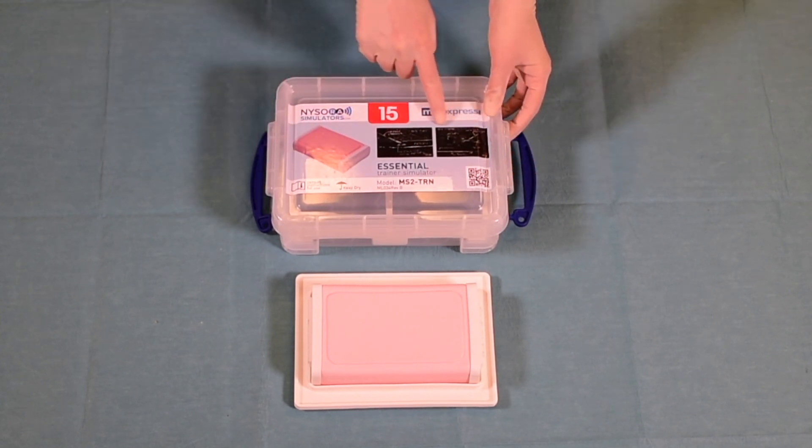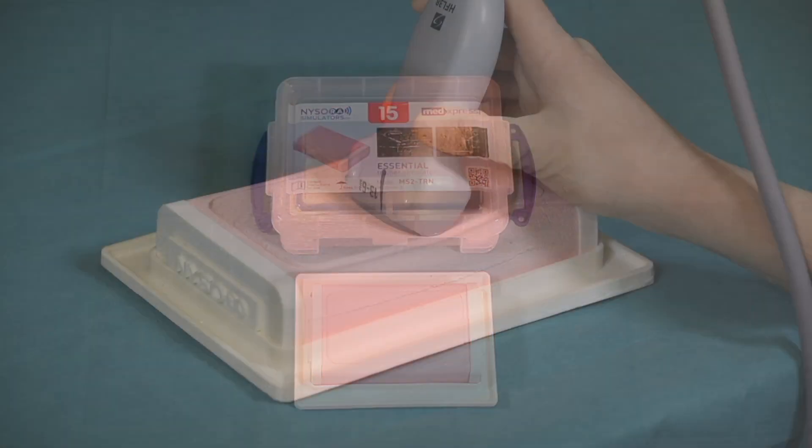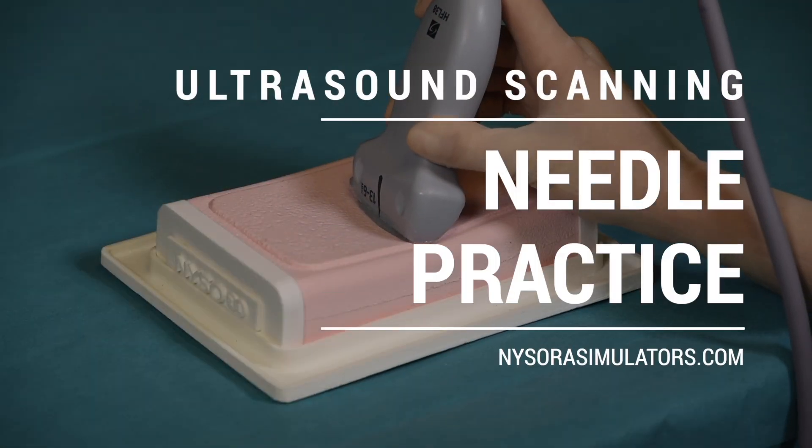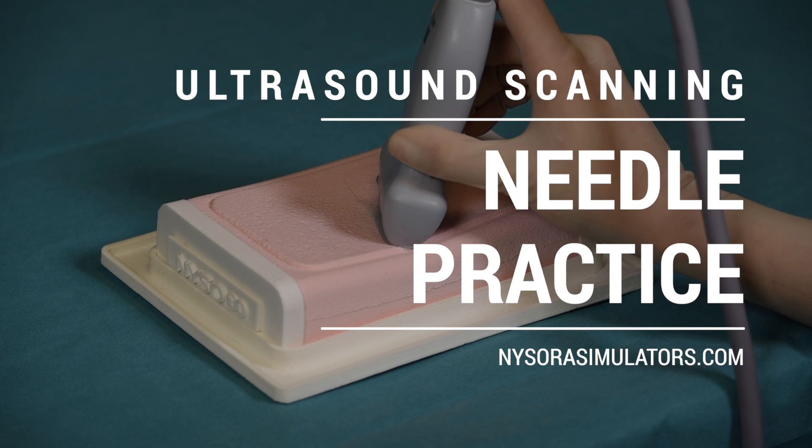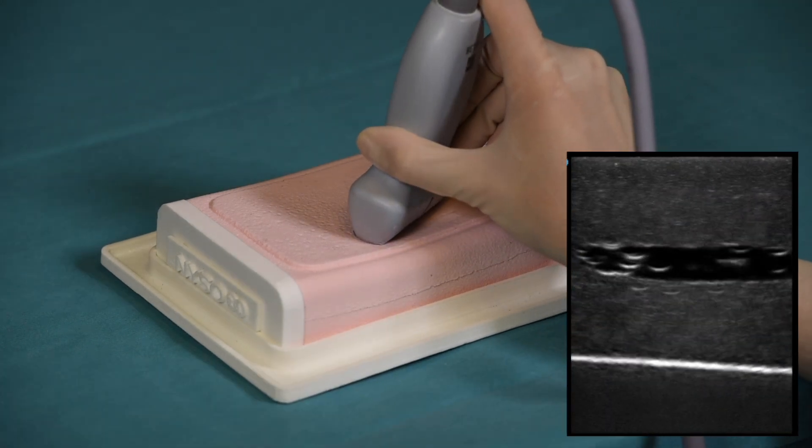The custom designed box contains clear instructions on its use. Practicing with the Nysora Essential Trainer consists of visualizing anatomical structures using ultrasound in cross-sectional and longitudinal views.